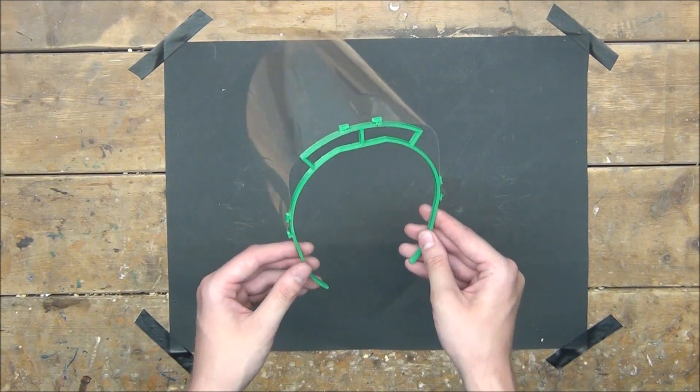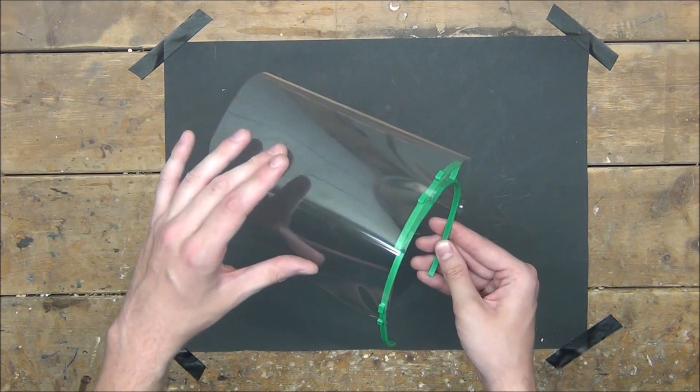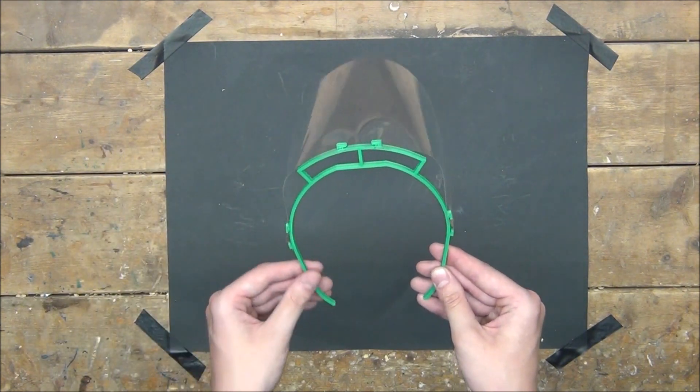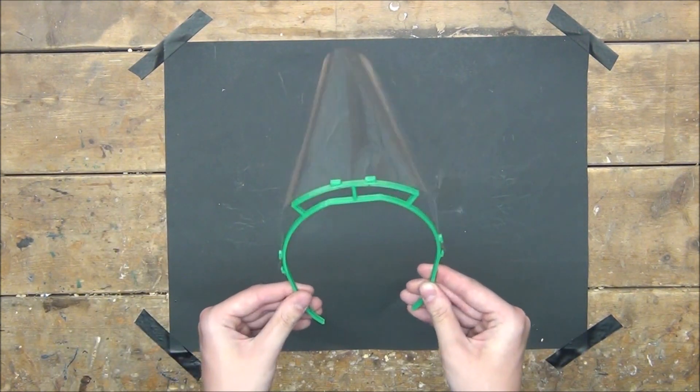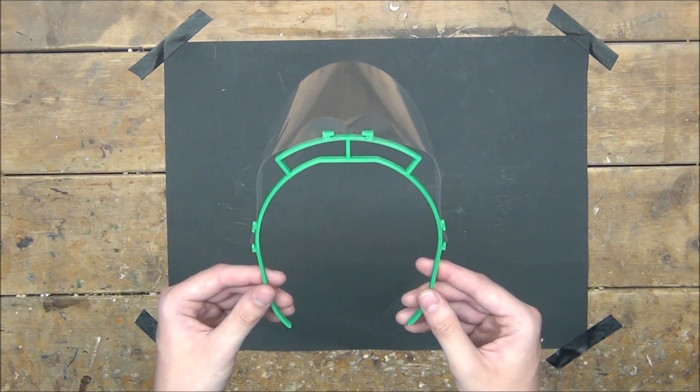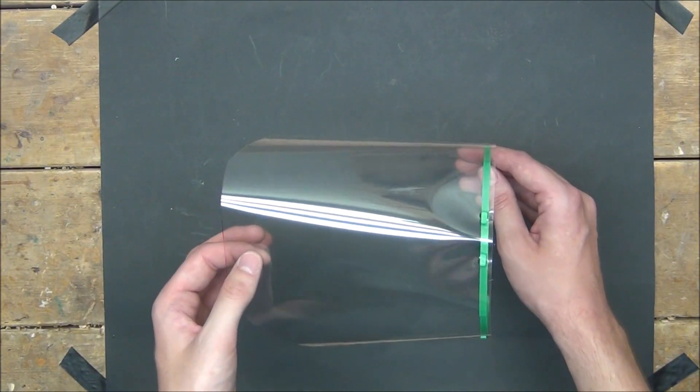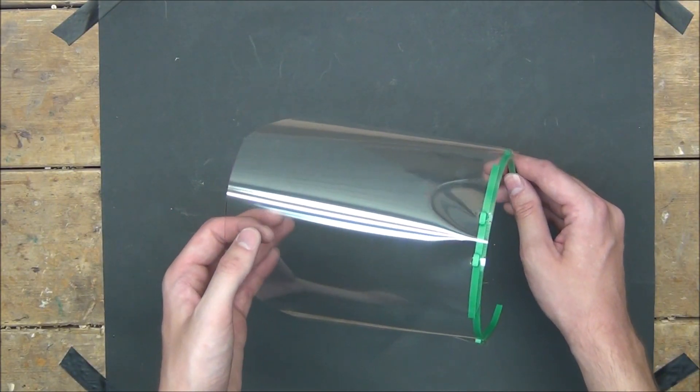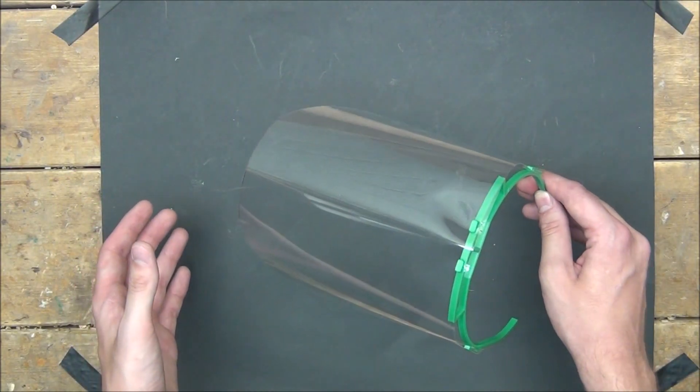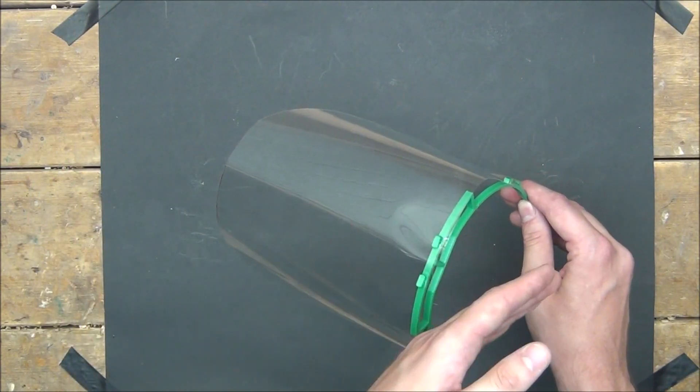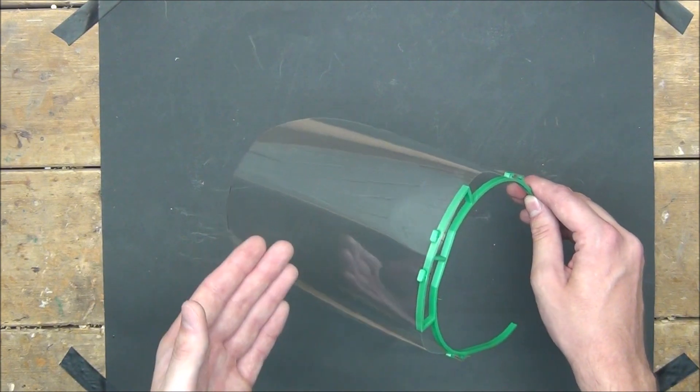Because of the pressure the transparency is putting on these hooks, it's really not going to go anywhere by itself. However, when the plastic does get dirty, replacing it is no big deal. Just do what I showed you in reverse.